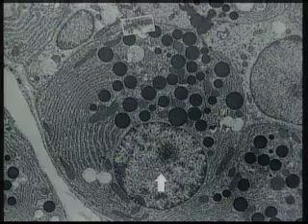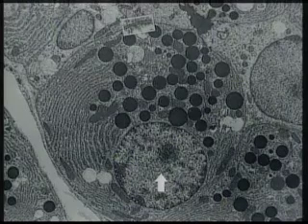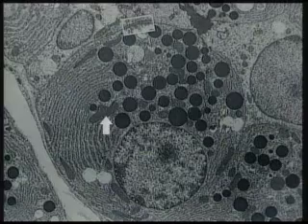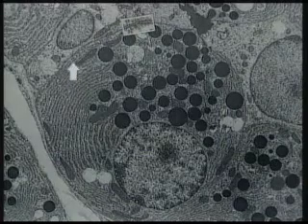This image is an electron micrograph of a pancreatic acinar cell, which is a cell which is involved with very rapid rates of protein synthesis and secretion. This image comes from figure 1-2 in your visual histology textbook, and the arrow right now is in the nucleus. The nucleolus is here, the rough endoplasmic reticulum is here, secretory vesicles are here, this is a mitochondrion right here, and in particular I want to call your attention to the cell membrane out here.